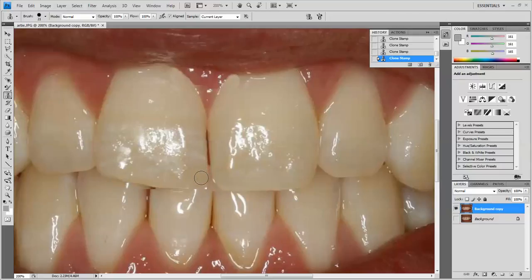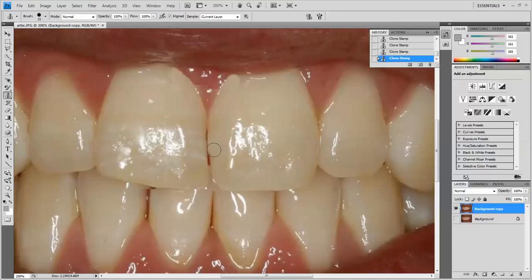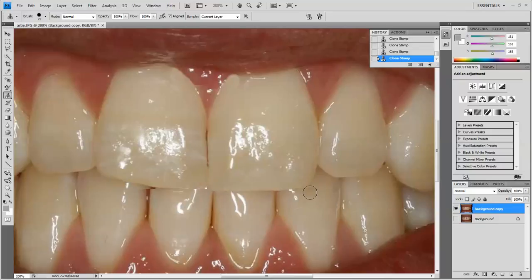So we're just clicking away, we're adding. We're basically digitally waxing the tooth. Now let's come over here and start doing the same thing on this tooth. We're just trying to close that contact up. We'll sample again. All right, so there we go.